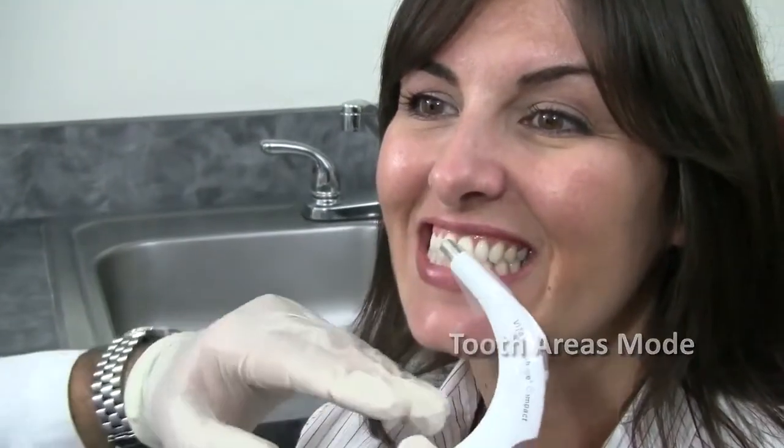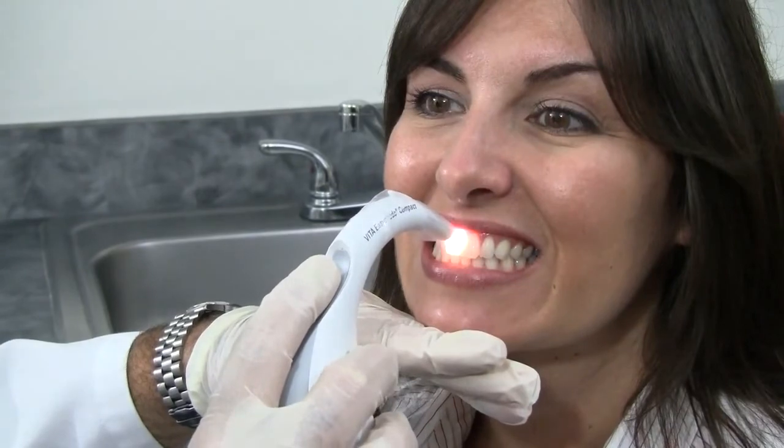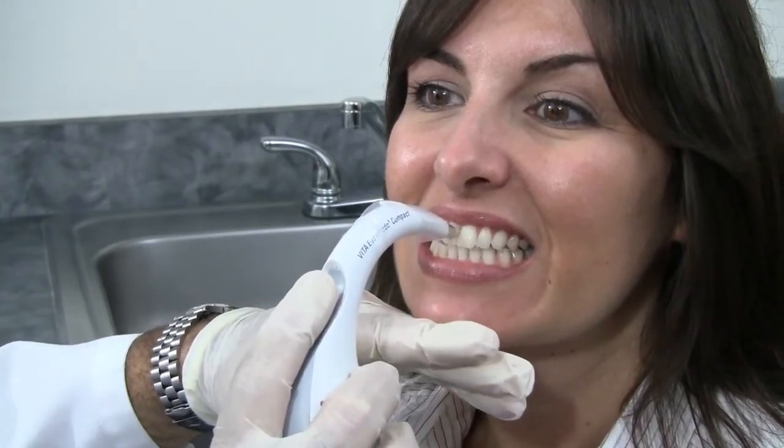Now I'm going to turn on the Tooth Areas mode. I'll start with the cervical, then the mid third.